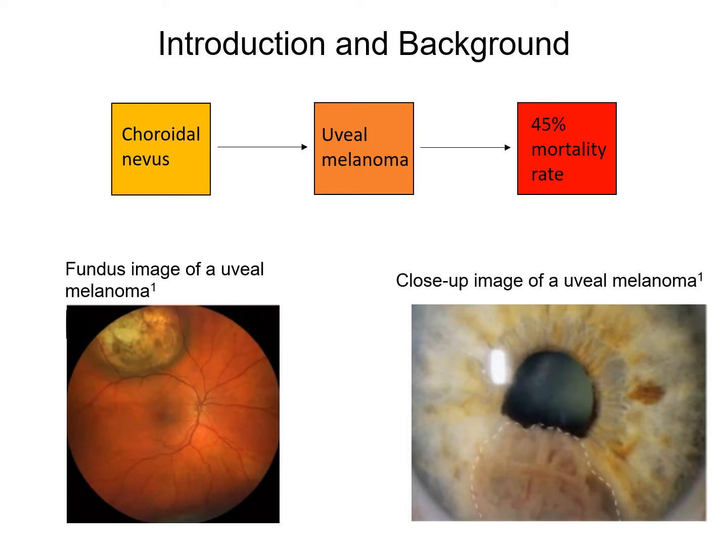This is partly due to the shortage of specialists such as ocular oncologists. But what we do have an abundance of are diagnostic images such as fundus images, which are photos of the back of the eye. We can use these images to train a diagnostic tool using artificial intelligence to identify uveal melanoma in an image. This will offload the burden on the healthcare system by mechanizing the skill set of ocular oncologists.